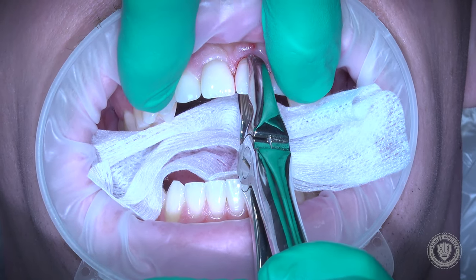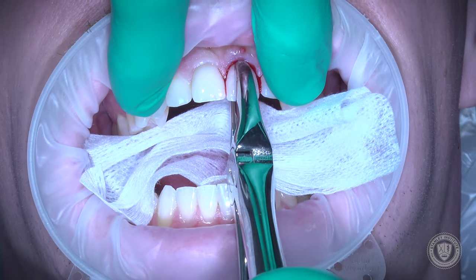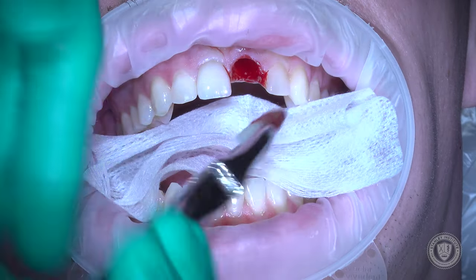In this particular case we haven't cut any of the time out, because I want you to see that it takes about maybe 15 seconds to take this tooth out. Rotational forces are key.